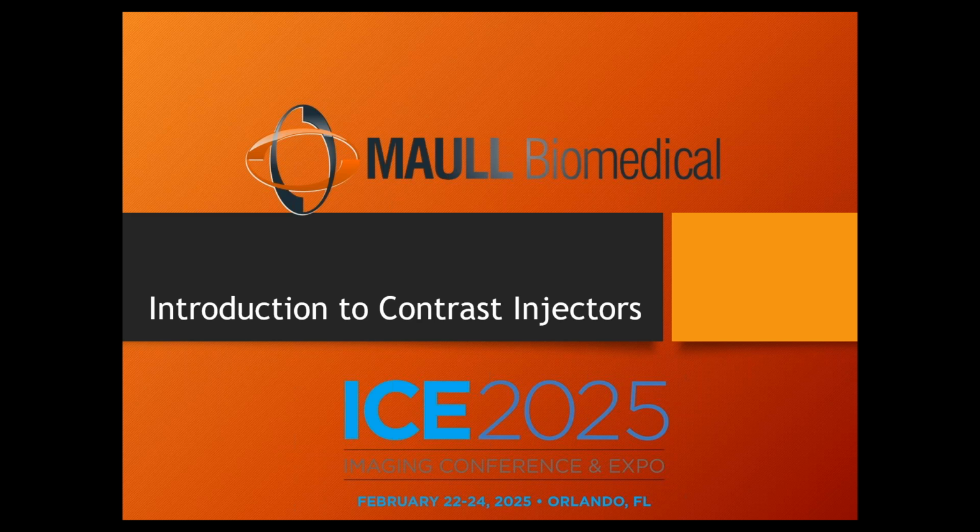The difference between how dark an image is and how bright it is is called contrast, the difference in white to dark. And that's why these are called contrast injectors, because they increase the contrast of the blood vessels on the images. All right, everybody clear? Cool.